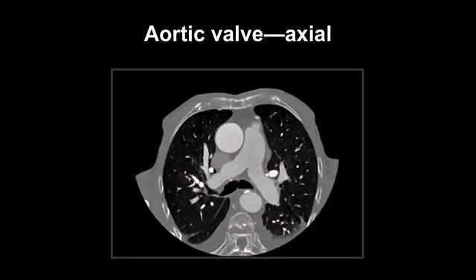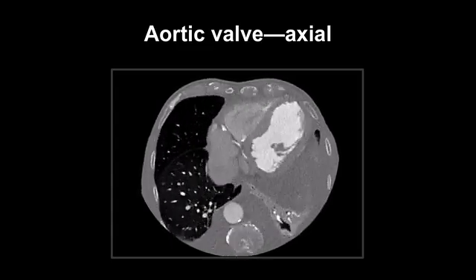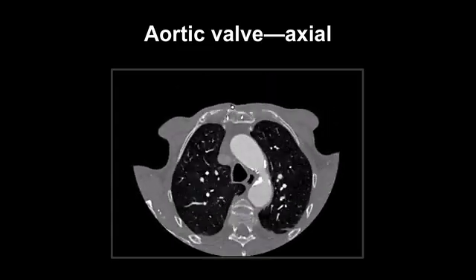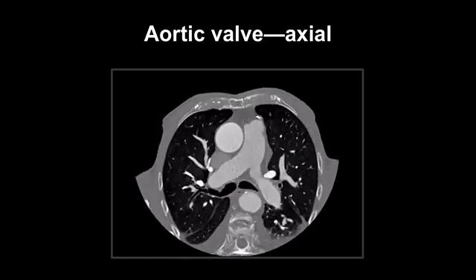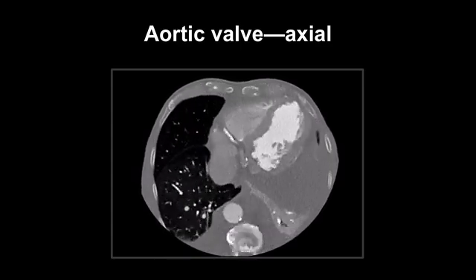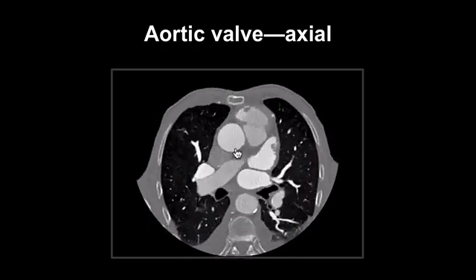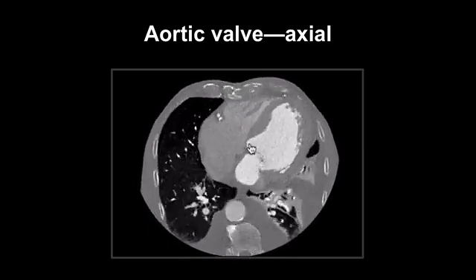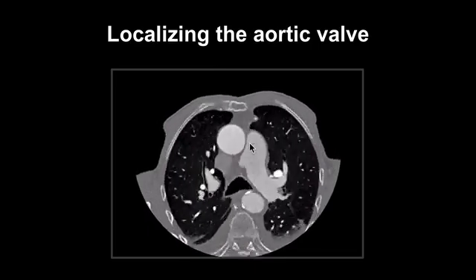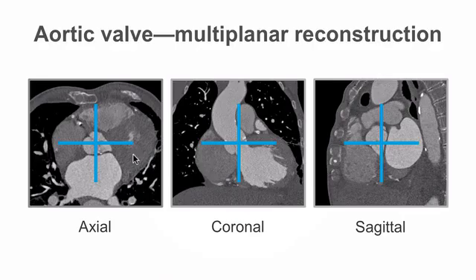On this scan, are you able to identify the aortic valve, and does it appear normal? Remember that the aortic valve is usually the one in the middle of the axial CT dataset. Here is the site of the aortic valve — as we come down the ascending aorta, we can see the aortic valve. I am localising the aortic valve and pausing at the point where it is seen. The left-hand image corresponds to the point where I paused on the previous scan.